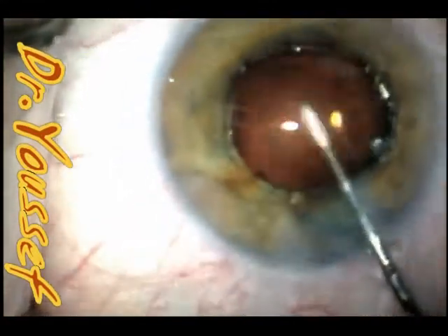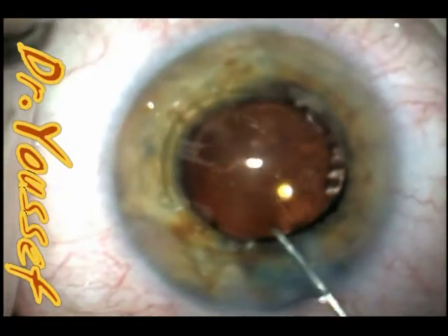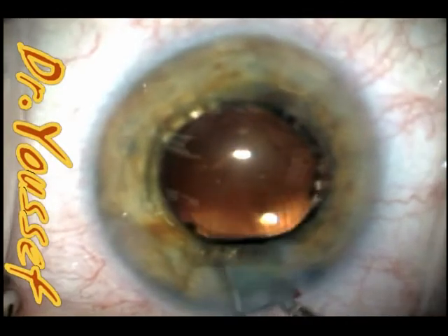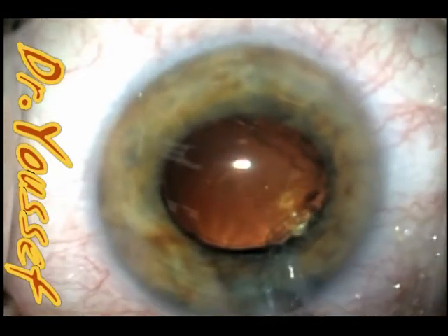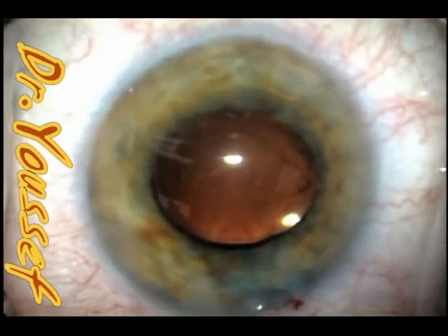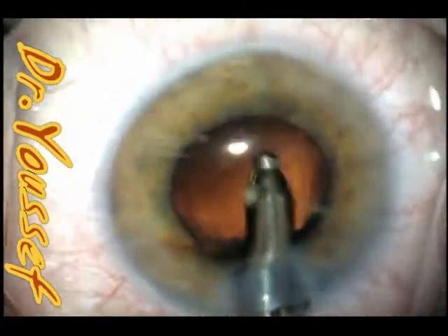I implant the lens and then dislodge the Malyugin ring to remove it before removing the viscoelastic, so you don't need to implant it again later. It's very easy — just go in with tooth forceps and roll it out of the anterior chamber. Now we can wash out the viscoelastic and do the irrigation and aspiration.